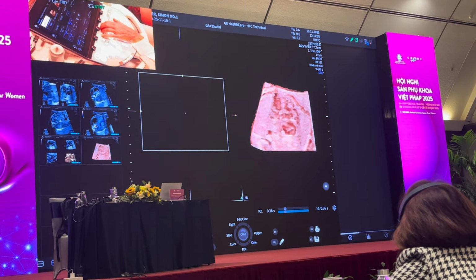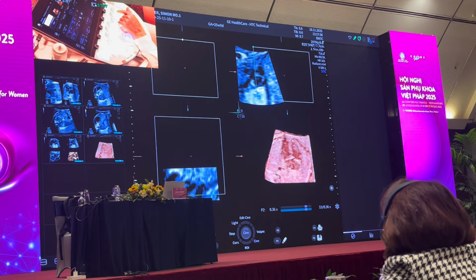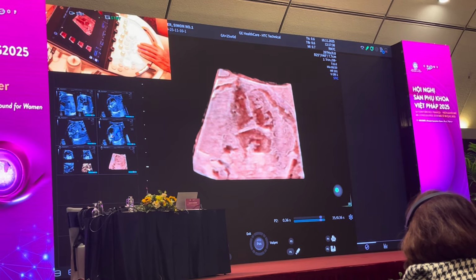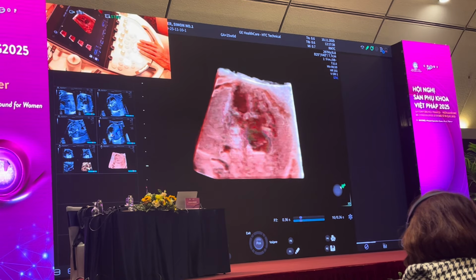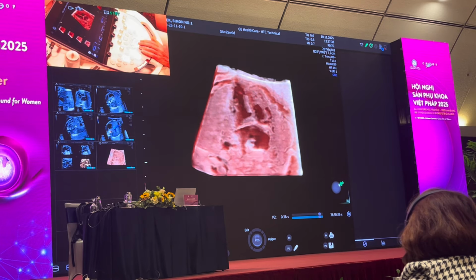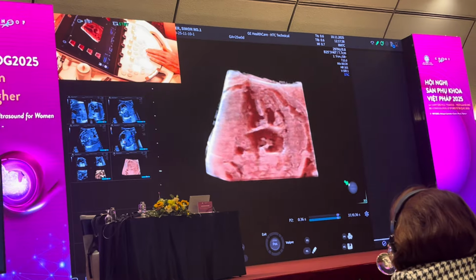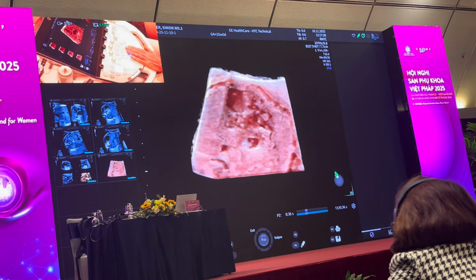I've manipulated one. And you can change your light source around this, looking at your atrium and ventricle. You come behind the heart, just here, the top left-hand corner. Your best light sources, when you do light source, is from 2 o'clock across to 11 o'clock. These produce the best results, in general, when you're doing 3D imaging.